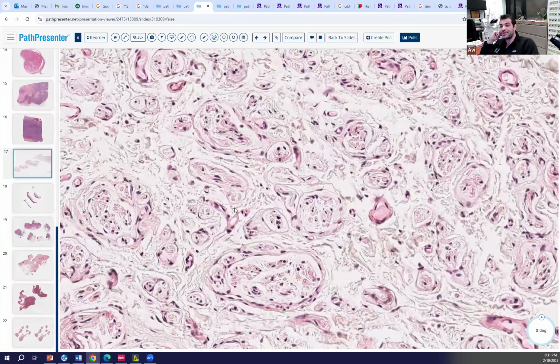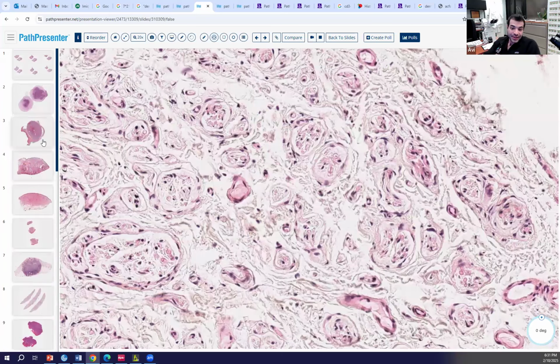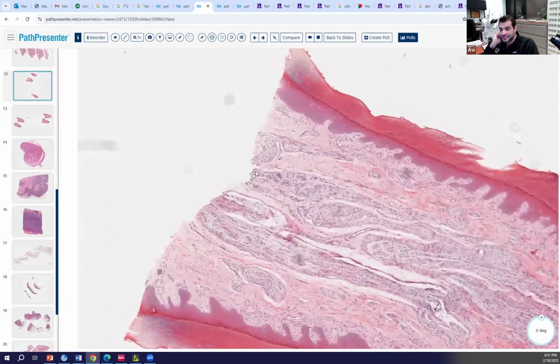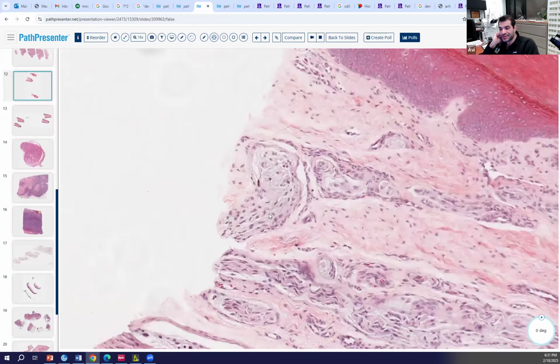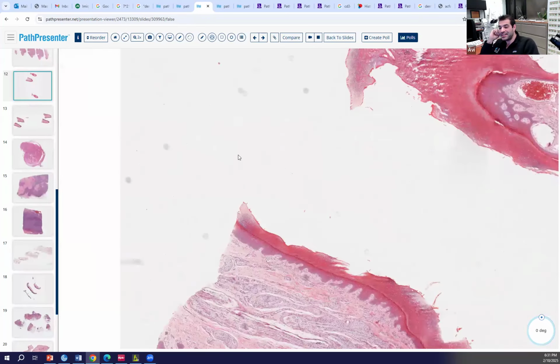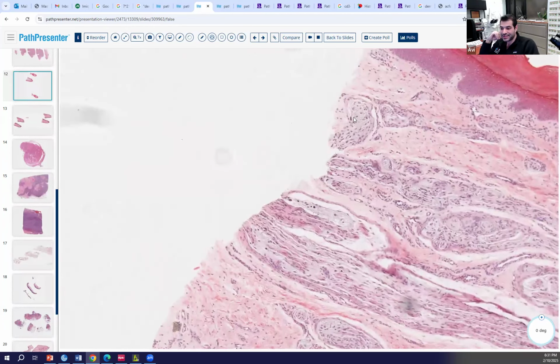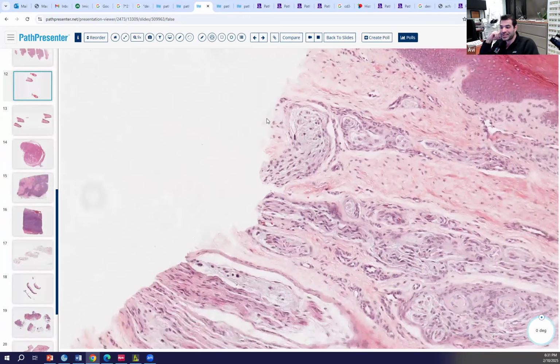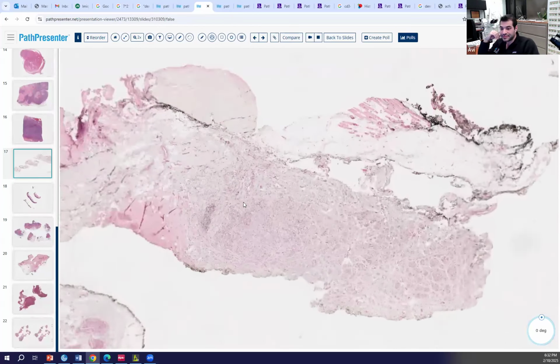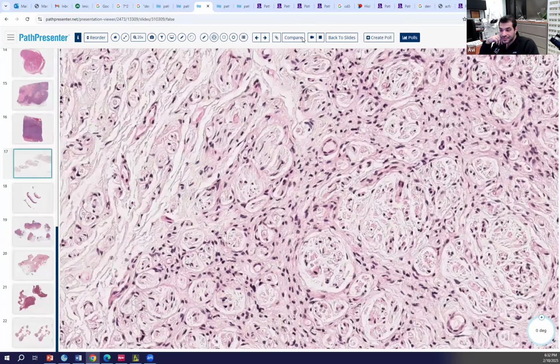We had an example where we had a supernumerary digit. In fact, maybe this one has it. Let's take a look, an example of a supernumerary digit that was amputated. I'd have to torture these little bundles into an amputation neuroma. But I've seen an example of an amputated supernumerary digit where right at the end, you can see these little bundles of nerves as an amputation neuroma. But that's basically the look. Disorganized bundles of nerve.